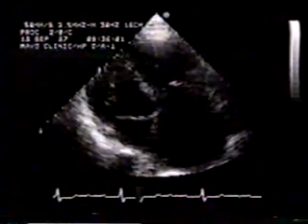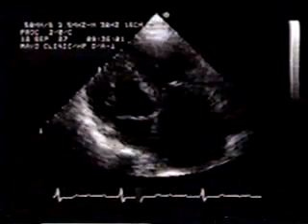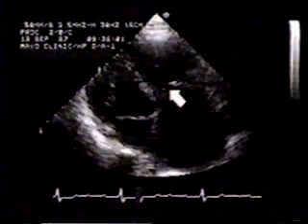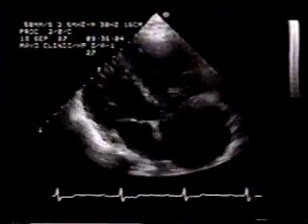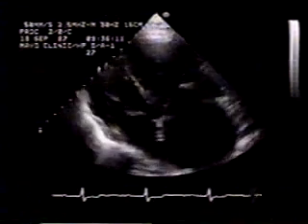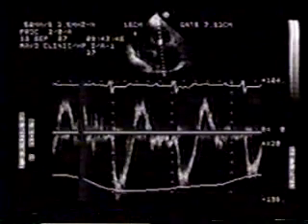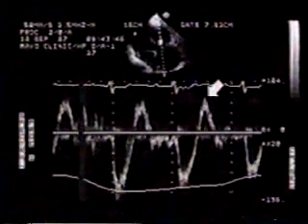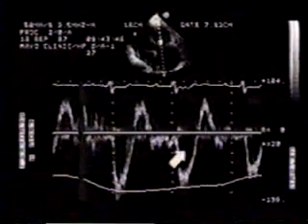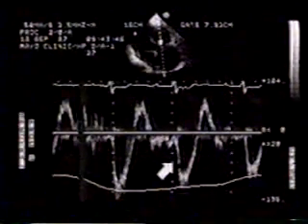This apical four-chamber view is modified to focus on the huge right ventricle and right atrium. Because of marked RV enlargement and dilatation of the tricuspid annulus, the tricuspid leaflets do not coapt in systole. A pulsed wave sample volume has been positioned on the atrial side of the tricuspid leaflets. The spectral display shows an early diastolic velocity of 0.7 meters per second. The tricuspid systolic signal is completely laminar. This low velocity, laminar signal is due to severe tricuspid regurgitation.